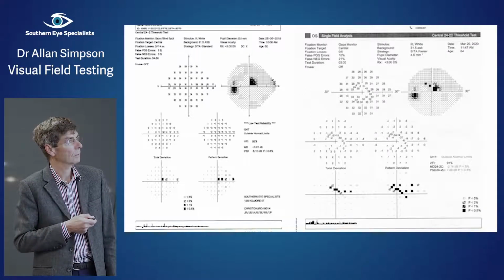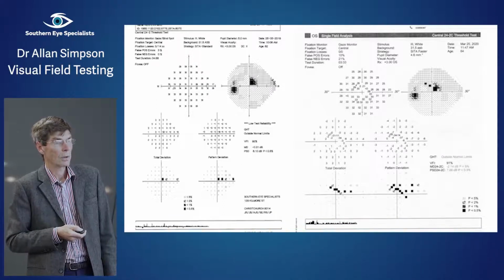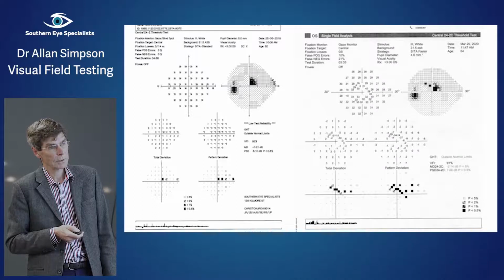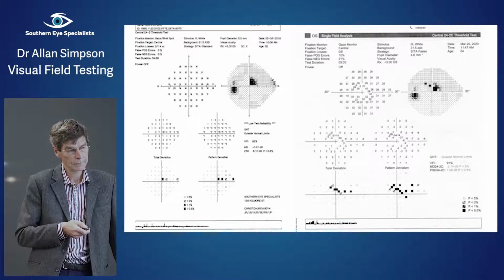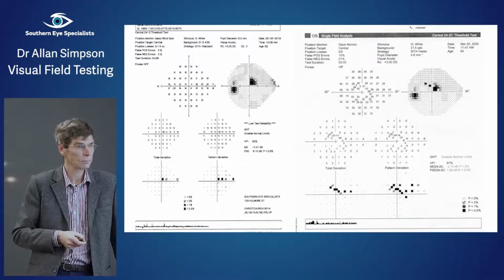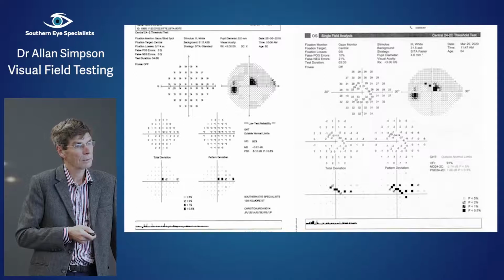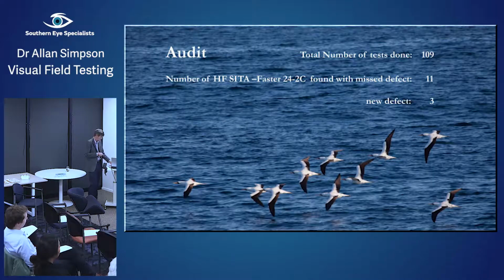Here's another one, a 62-year-old with nearly 5 minutes on the old test and 3.5 in the new. Here is a pretty good test and probably a fairly bona fide typical superior arcuate scotoma. Looks a little bit different than the ones we had before because there's a few more points put in there. Those 10 extra points just make the pattern sometimes a little bit different because it's picking up more of it and displaying more of it compared to what's displayed here. But that might be a more accurate depiction of what's actually going on than the older one. In fact, that's the last one.